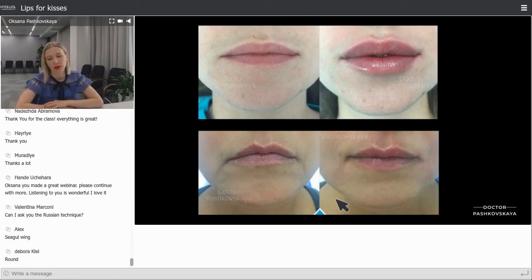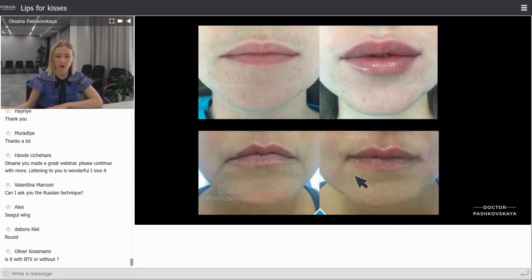only used the filler, but in the technique, not the Mona Lisa, but like a reverse of the corner, when you inject in the wrinkle, in the fold, and go through the corner, through the commissure line in the upper lip, and then make your needle mostly parallel, or even higher in that direction.